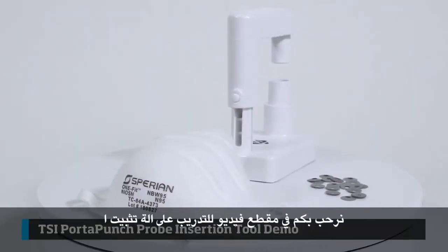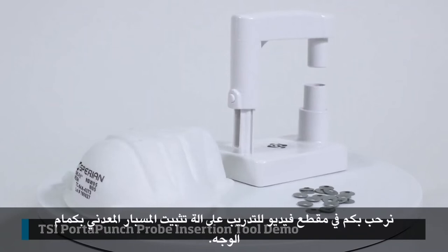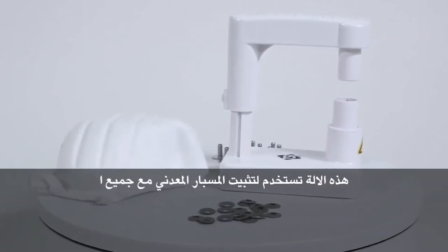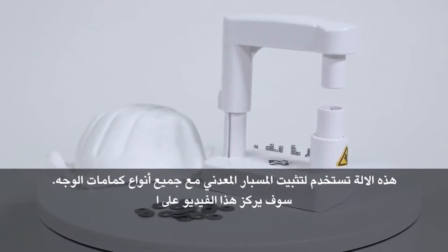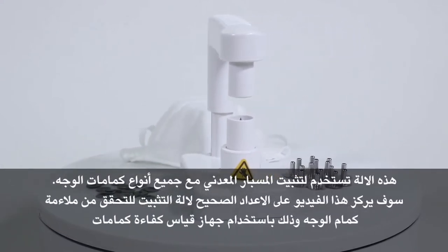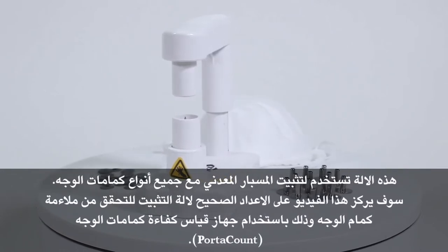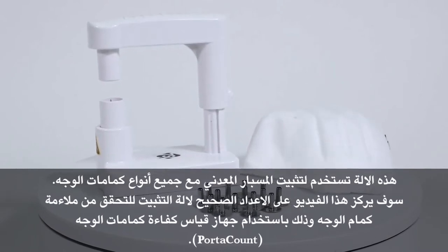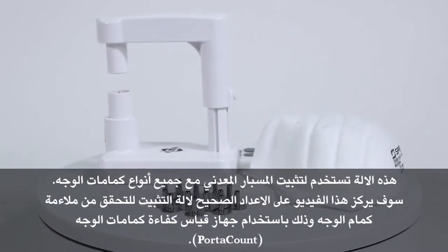Welcome to a training video on the TSI Porta Punch probe insertion tool. This probe insertion tool is used to probe all types of filtering facepiece respirators. This video will focus on the proper setup and probing of a filtering facepiece respirator using the Porta Punch probe insertion tool.